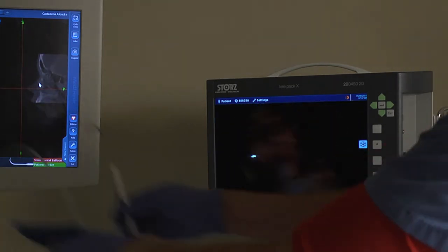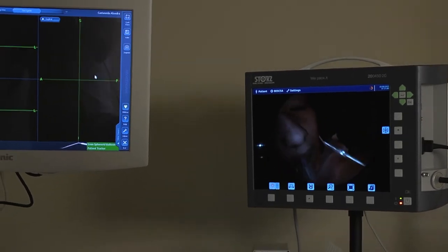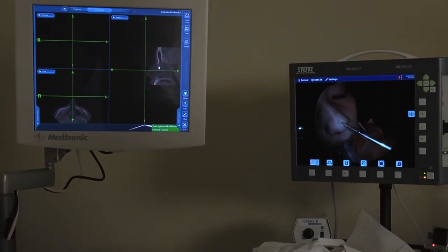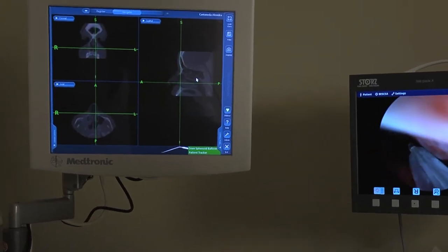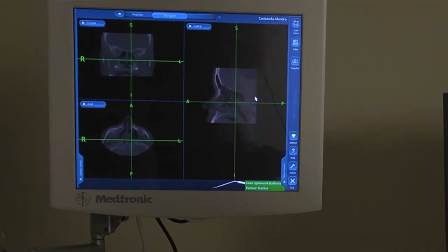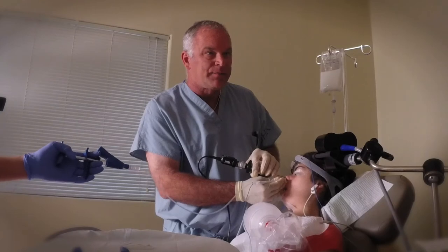Okay, now we're going to go back into her sphenoid sinuses. I'm going to check the balloon with a visual reference point, which in this case is the nose. And it's right on. So we're going to go in here and find her sphenoid sinus, which is way in the back of the nose. Using the computer to help me get in the right position. And I'm already in it.